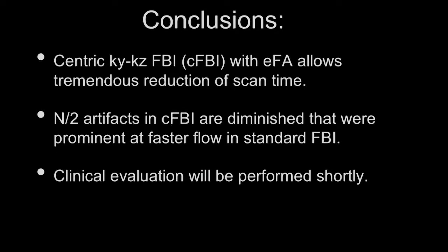In conclusion, centric FBI with the exponential flip angle allows a tremendous reduction of scan time. The N/2 artifact, which was prominent in standard FBI, was almost diminished. Clinical evaluation will be performed shortly.